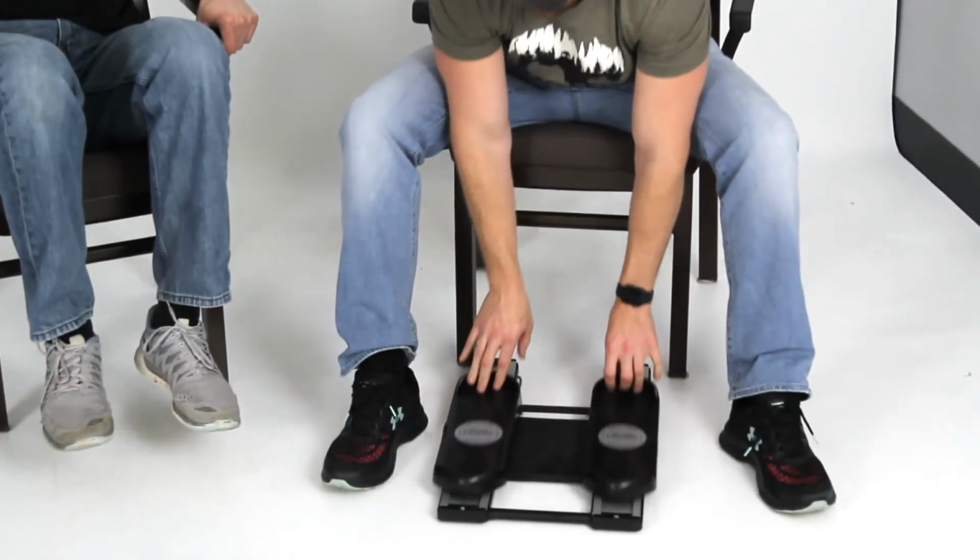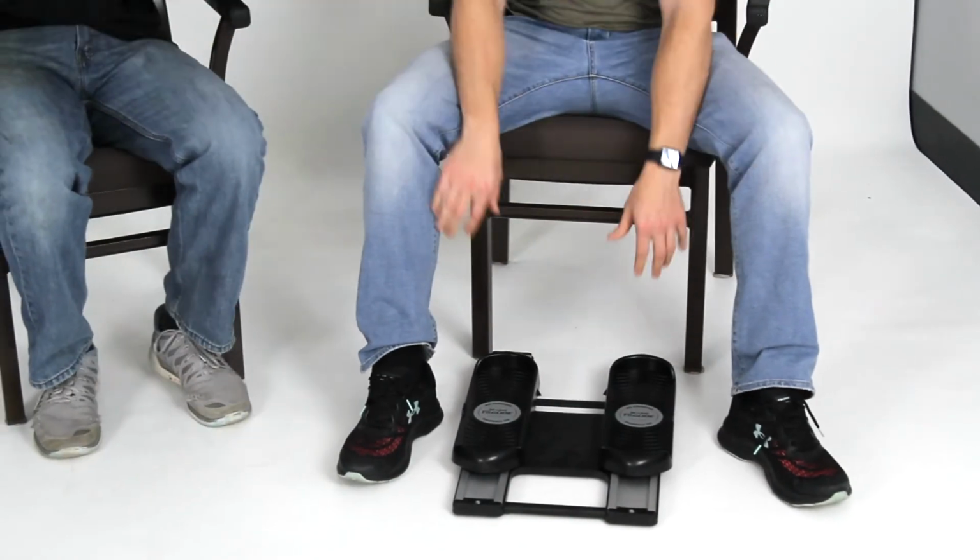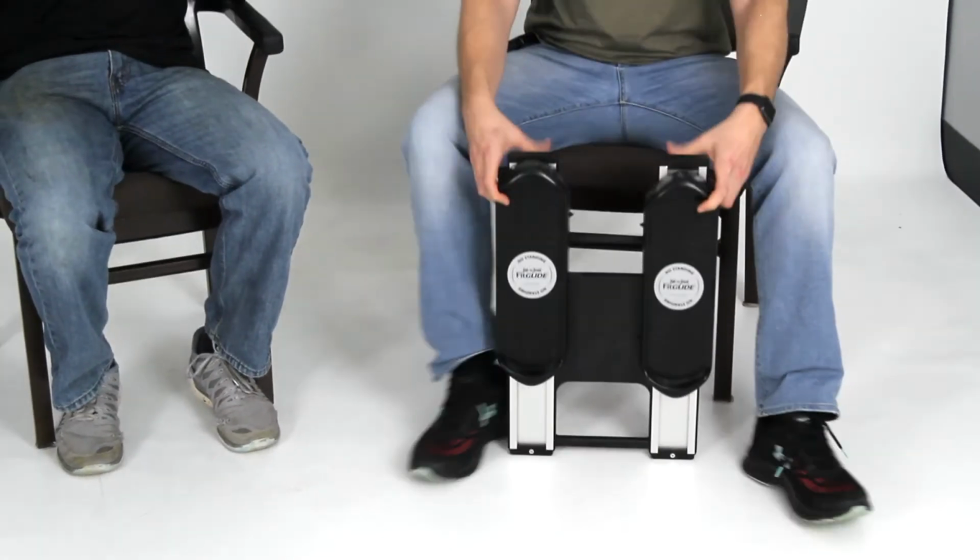If you want to work your hamstrings a little more, Mike would work in the decline position here. He could even add some cuff weights on his ankles to make it a little harder. He could put it flat if he doesn't want his hips flexed at all. Mike and I are both physical therapist assistants, so we worked with a lot of patients, and a lot of times you'd start in the flat position if somebody had a hip or knee replacement and didn't want to have their knees or hips flexed.